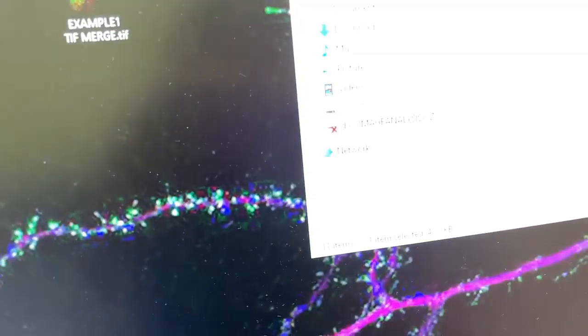You get this checkerboard effect, a very obvious crease like this. Whereas the big expensive slide scanner does not do that. I'm going to have to go in and take images specifically for the sake of getting reference images. Are any of these usable? Probably not.